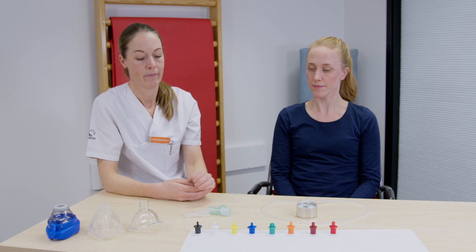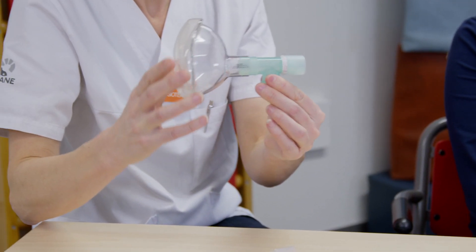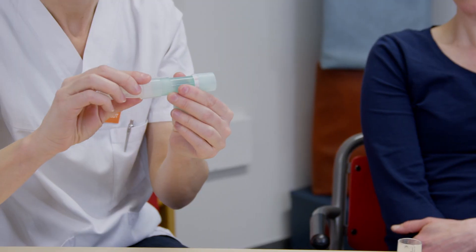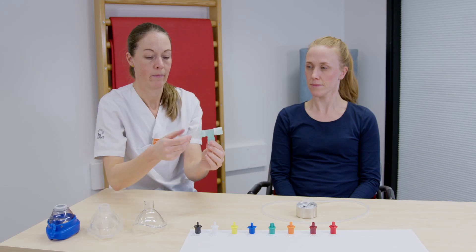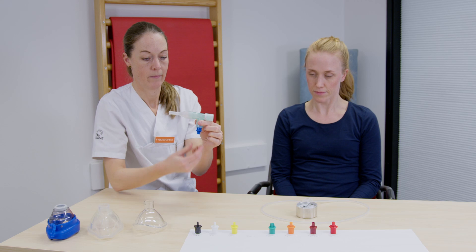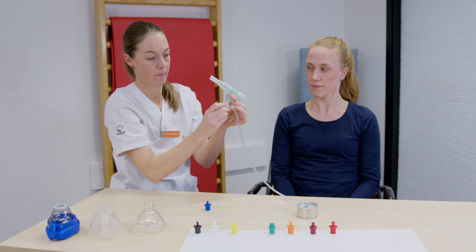Så här sätter du ihop din pepputrustning. Mask eller munstycke placeras här. Motståndet placeras här. Om du ska använda en tryckmätare, så kallad manometer, placeras den mellan motståndet och utandningsöppningen.